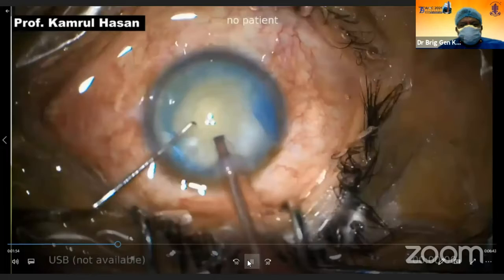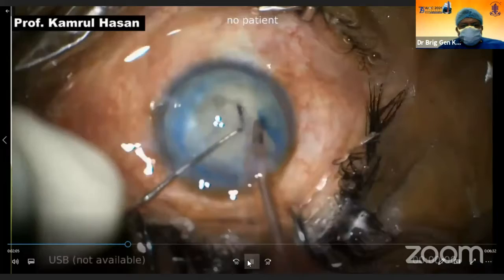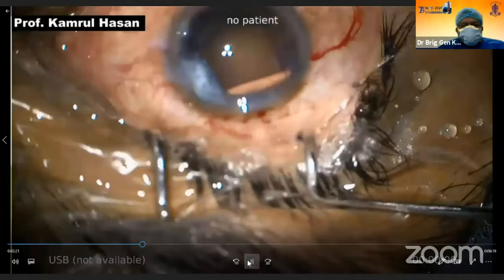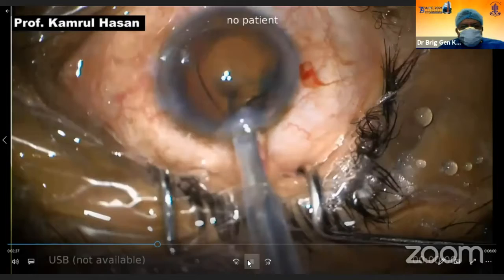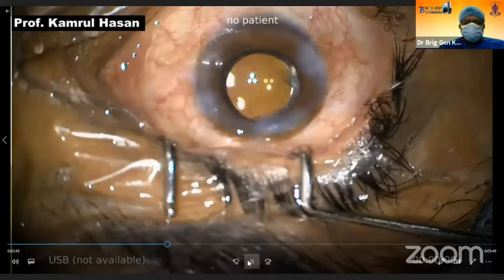Now I started doing phaco. Sculpting is going on. Breaking of the nucleus with chopping mode, rotating, making multiple pieces, and doing the phacoemulsification slowly with controlled phaco power. You see, it is being done quite smoothly. Now, cortical removal is being done using the simple cannula to give less pressure on the capsulorhexis part. Then a foldable single piece intraocular lens was implanted. I did not try to rotate too much, removed the remaining viscoelastic, and the surgery is over.